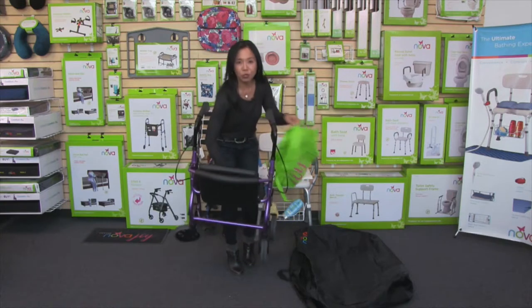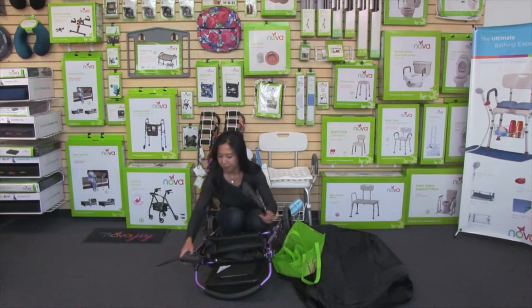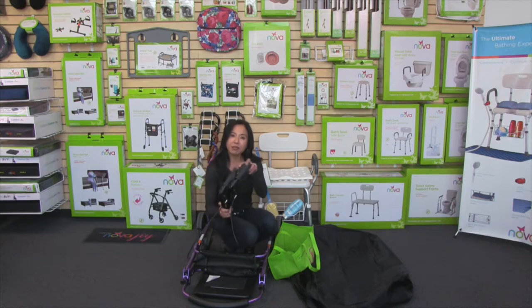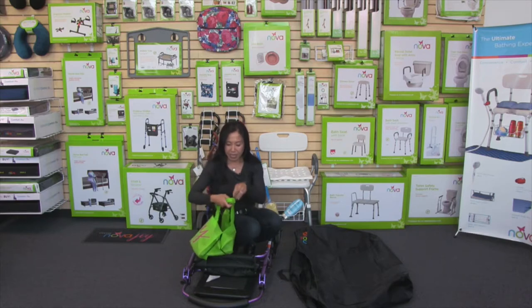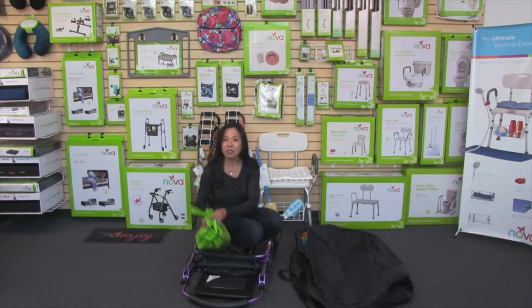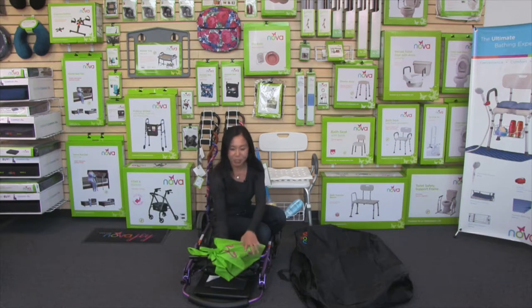Go ahead and fold your walker up and remove the handbrakes. Put the handbrake side into the grocery bag and tie it up to make sure it stays nice and secure. The purpose of this is so the handbrakes don't flop around and stay protected while in the travel bag.